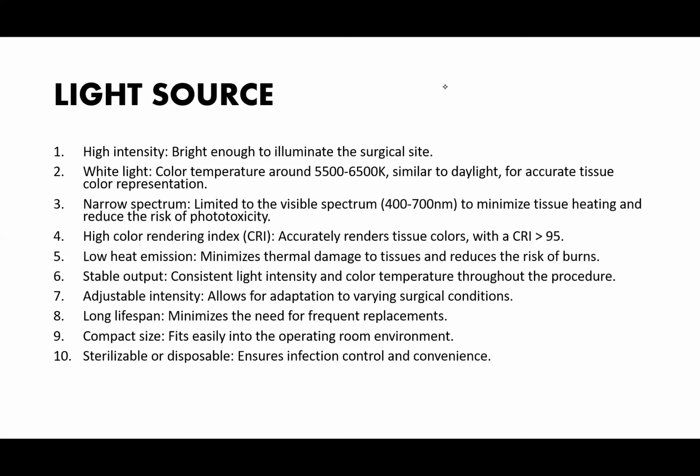So our next lecture is the continuation of the classification of laparoscopic instruments. It is very important you don't miss all this, because all these theoretical aspects will form the foundation of what we will do in the dry lab.